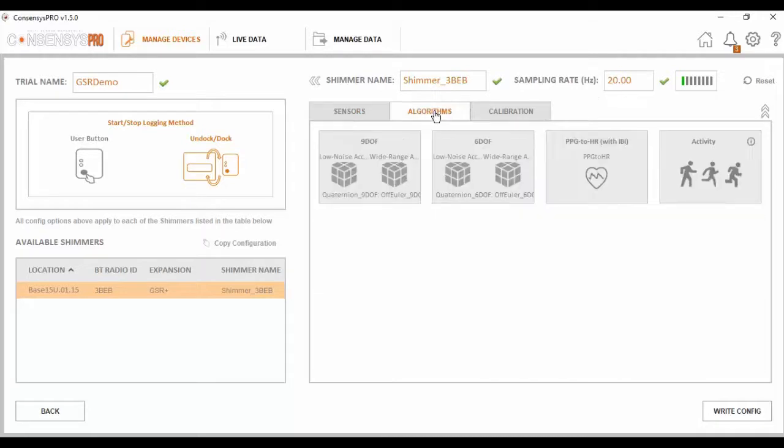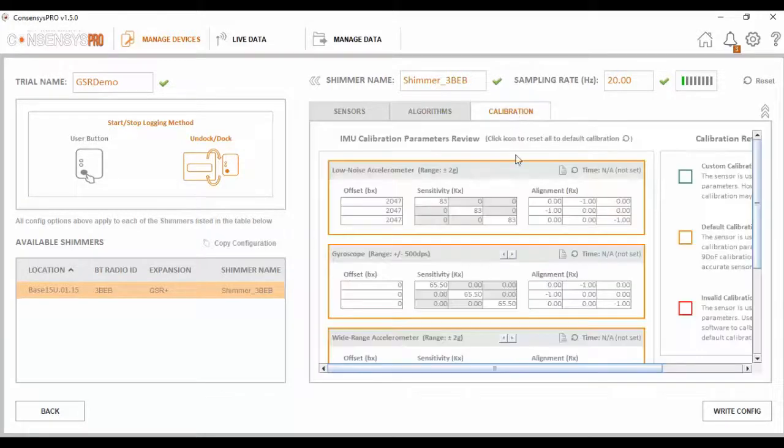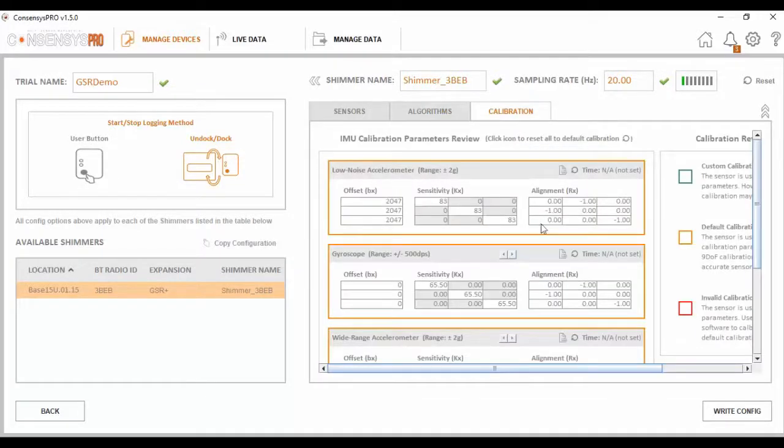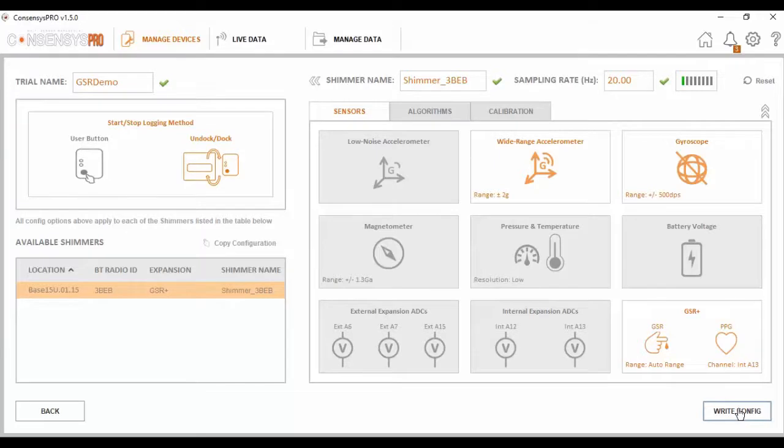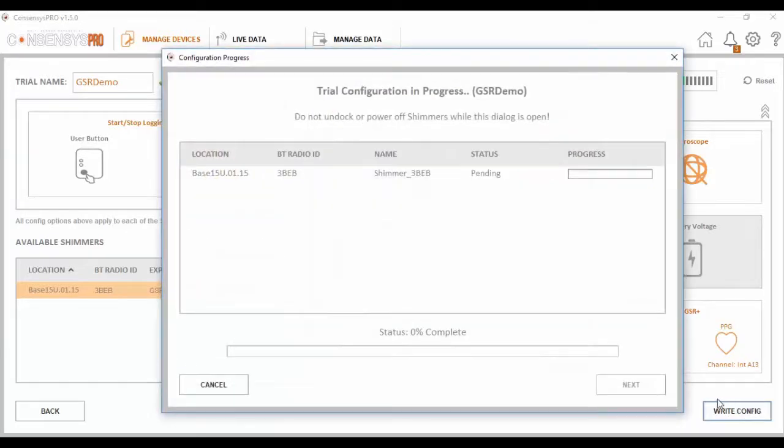We can also add algorithms to this trial if we so wish, such as PPG to heart rate. The final tab to consider is our calibration settings. At this point, if I am happy with the sensing signals I have enabled and the various other settings, I can write these settings to the shimmer by pressing write config down here.